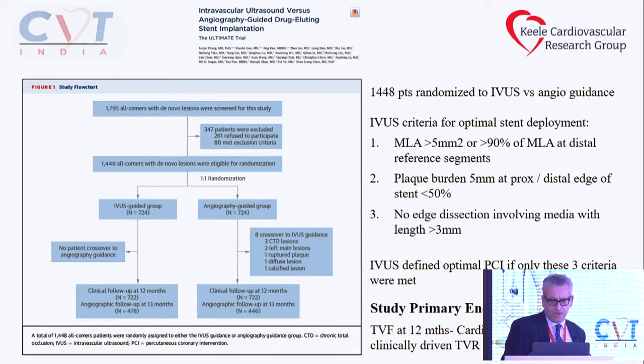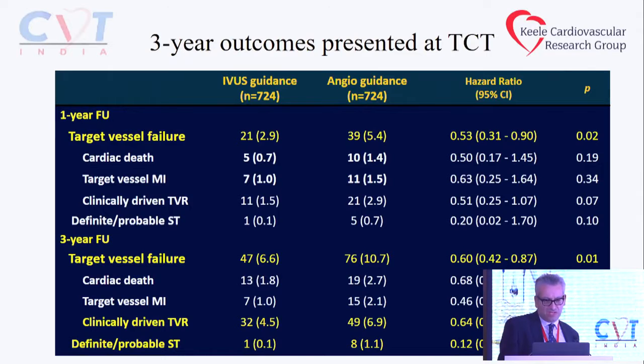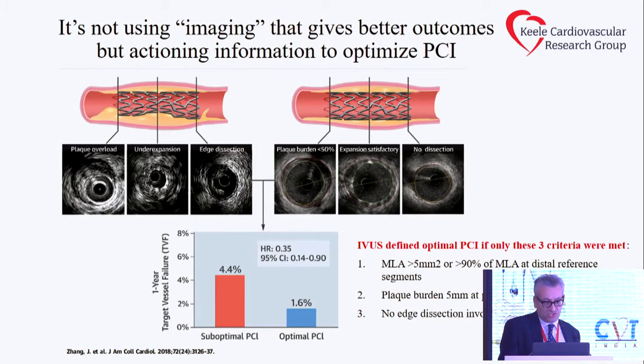We also know that imaging is associated with better outcomes from the ULTIMATE trial, and we also know that it's not just doing imaging, it's acting on it. So this slide has already been shown.